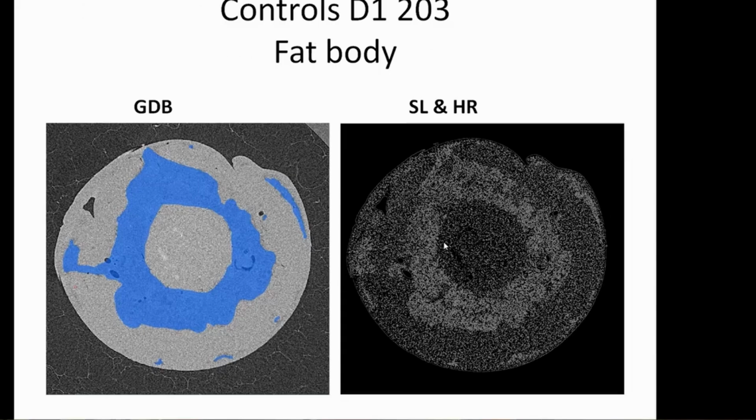Their results seem to be gratifyingly similar to those that I had obtained just using the eyeball, but obviously these are much quicker and less labour intensive.